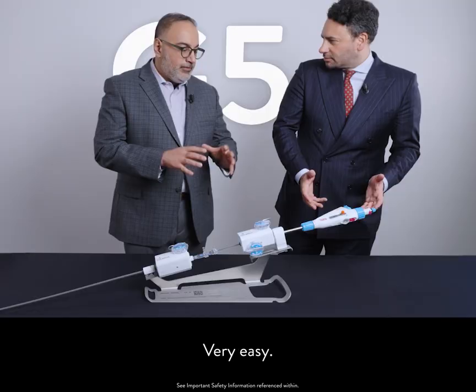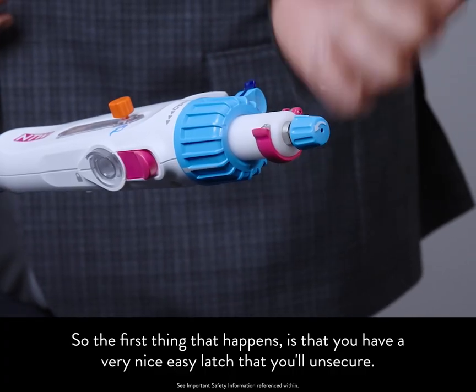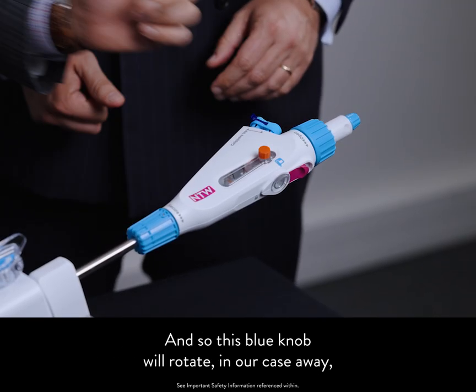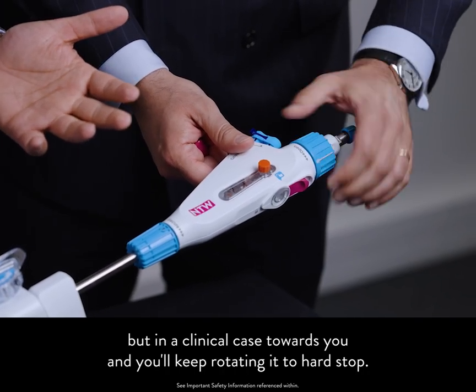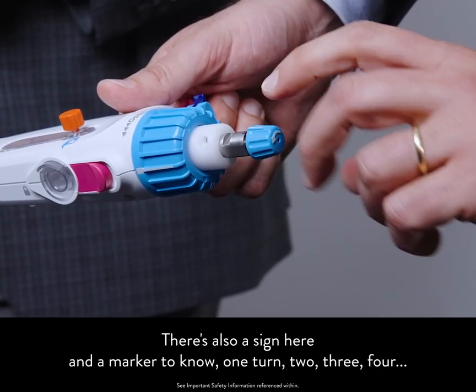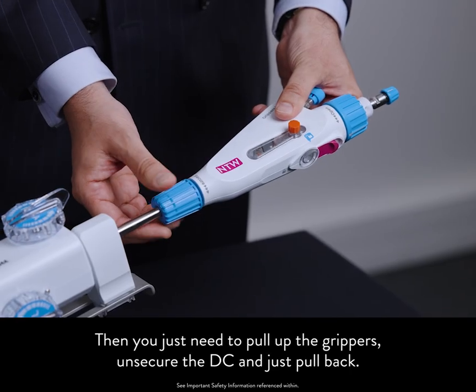How do we deploy the clip? Very easy — none of that has changed except a few features that make it easier. After final arm angle number one, you do final arm angle number two, and you're ready to deploy. First, there's a very nice easy latch that you'll unsecure — that gives you something to brace onto, and then you pull that pin out. Much easier. Now we focus on the knob. This blue knob will rotate — away from you in this demo, but towards you in a clinical case — and you keep rotating to hard stop. Once at hard stop, your groove is exposed and you're ready to do your eight turns to deploy. There's also a marker so you can count one, two, three, four turns. Then you pull up the grippers, secure the DC, and pull back.